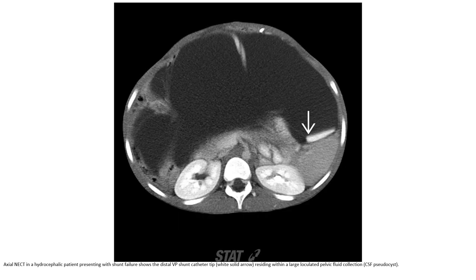Non-contrast CT in a pediatric patient presenting with shunt failure. The distal VP shunt catheter tip is residing within a large loculated fluid collection.